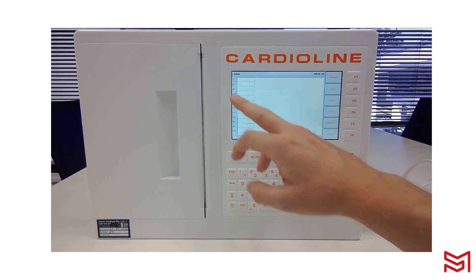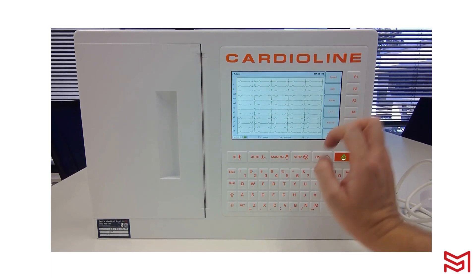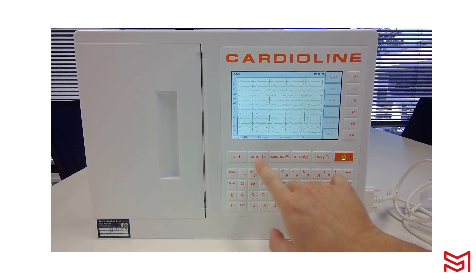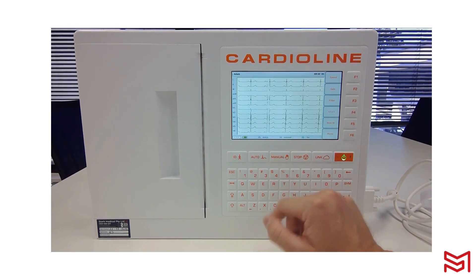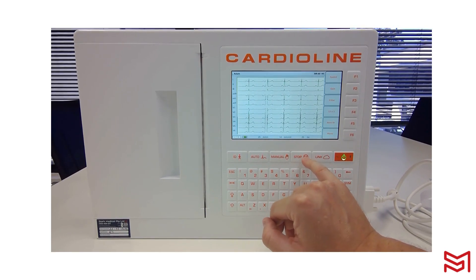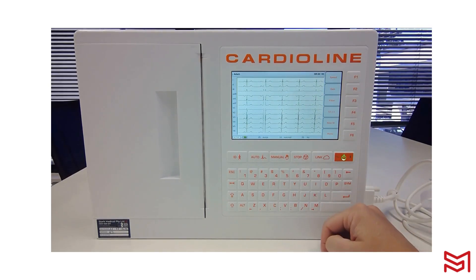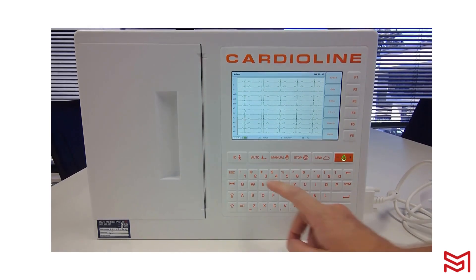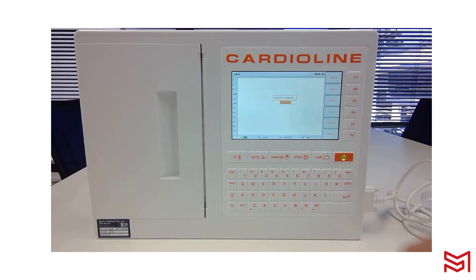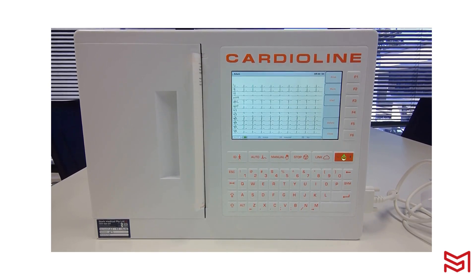Now I have my patient name in the top left-hand corner of the ECG device and I'm ready to capture an ECG. I can click Auto for a 10-second capture, Manual, or Manually Print Paper. To stop the printout, hit Stop. Link is used when inserting a USB stick into the top of the device to export data. I'm going to click Auto, which will run its analysis and automatically print my ECG.